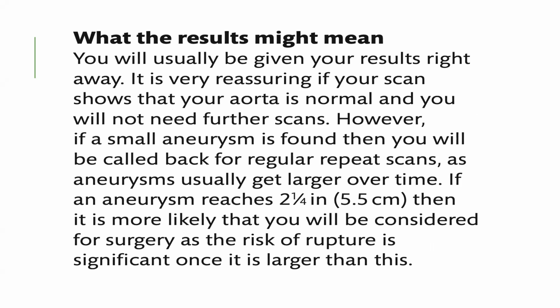What the results might mean. You will usually be given your results right away. It is very reassuring if your scan shows that your aorta is normal and you will not need further scans. However, if a small aneurysm is found, then you will be called back for regular repeat scans, as aneurysms usually get larger over time.